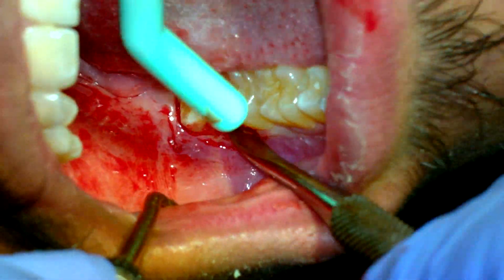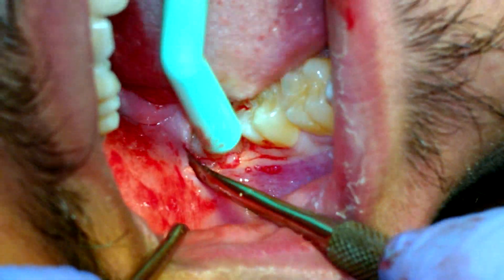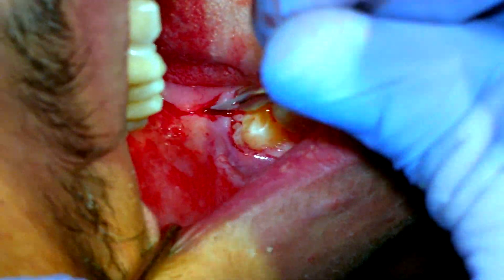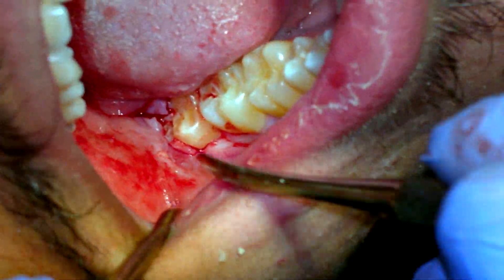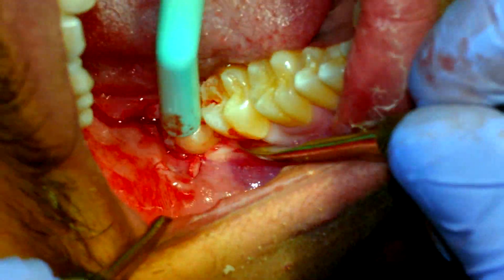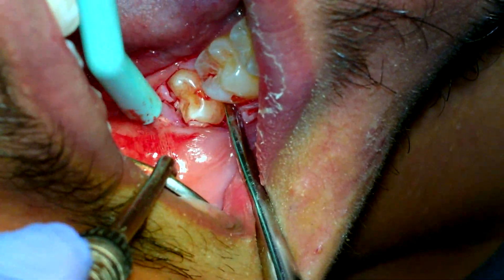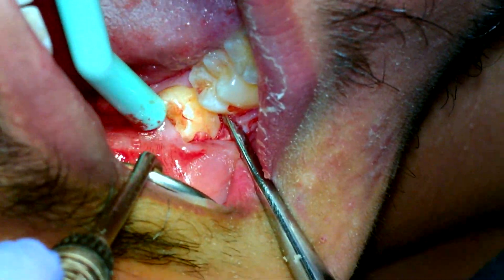Turn to your left for me. Now 32. Does anything hurt here when I touch? Good. I'll just make a small incision there. I don't want to flap it just yet. Make sure he doesn't bring his hands up there. So if I can take it out without troughing and flapping, it's a good day. Let's elevate a little and see if it comes out. I see some movement — that's always a great sign. I see more movement, so I'll just ease it and ease it.